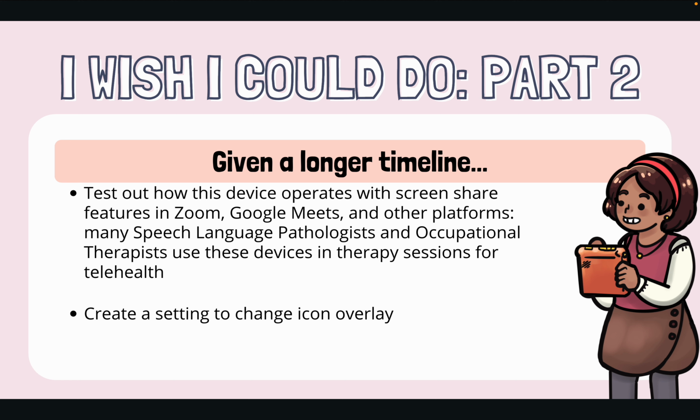They still need to have a break, and maybe this could be a way of letting the therapist know that this is too tiresome for them. They need a break. They can't do any more. They need a 5 minute something of bubbles or watching a video to get away from the task that's there, or just to be able to participate in their care and answer something like what questions about a book. I would also like to create a setting to change the icon overlay.